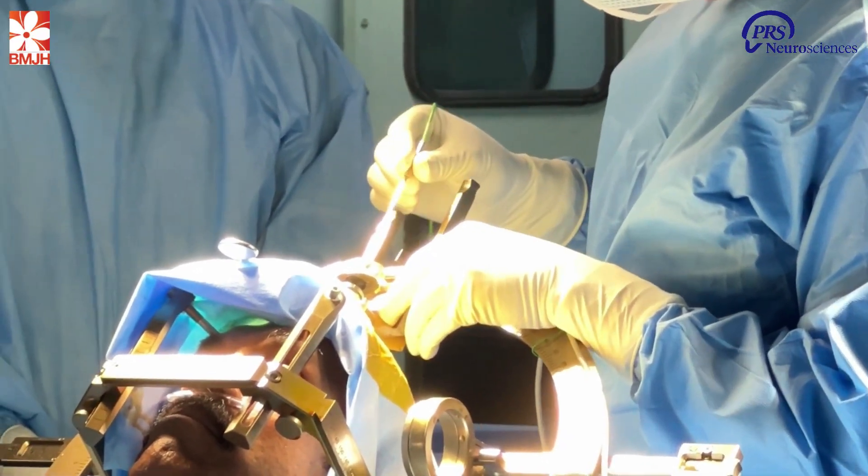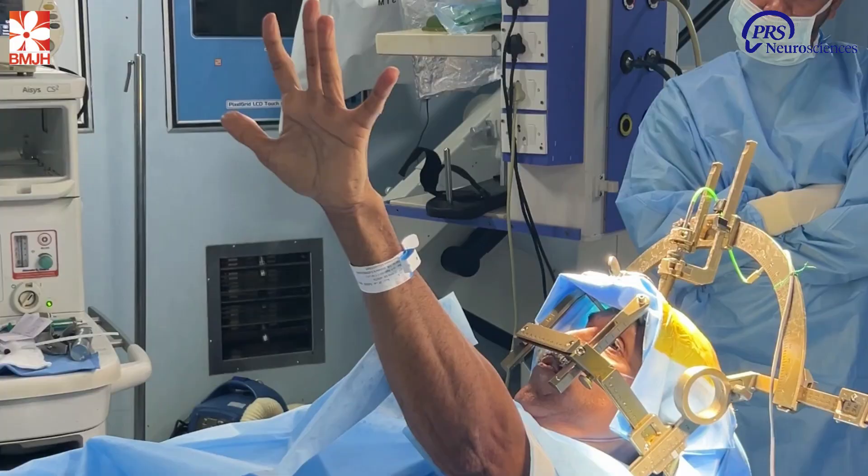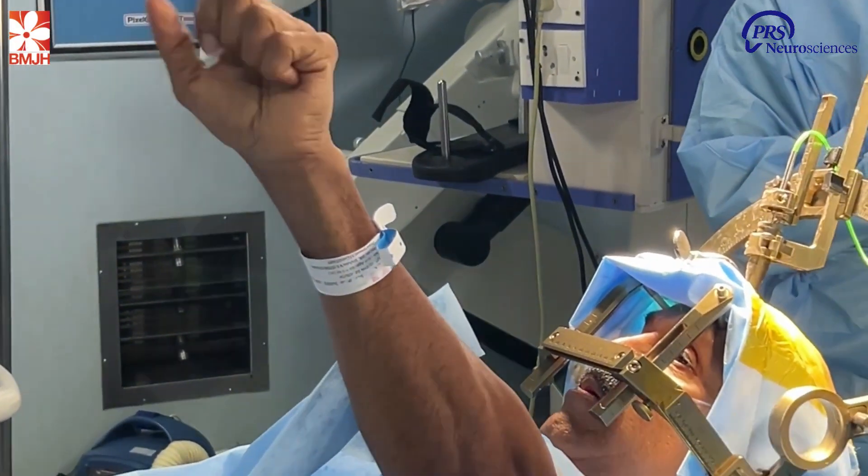This whole thing is under local anesthesia. He's fully awake — and that's how it is. I think it's worth spending seven hours. Then we take him to the OT. I have to make a 14 millimeter hole in the skull and put in an electrode based on the XYZ coordinates from the machine. Once I do that, I am normally nine to nine and a half centimeters inside — not millimeters, centimeters — that I can't see. That is where the technology, the computer, and the training help me make sure I'm in the right place. Patient feedback has to happen, which is why the patient has to be fully awake.